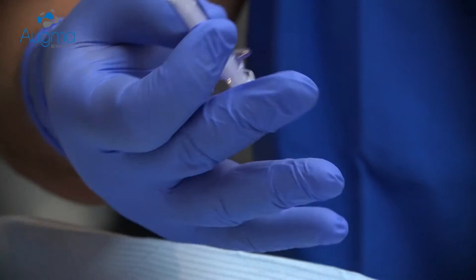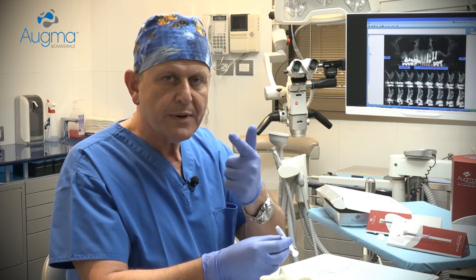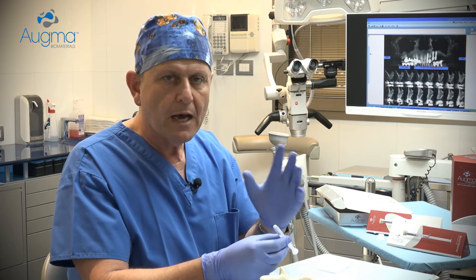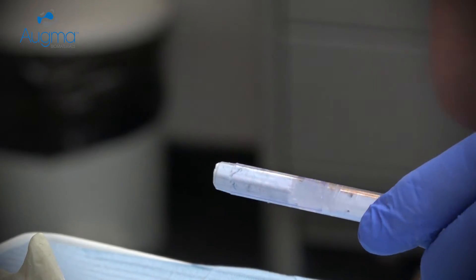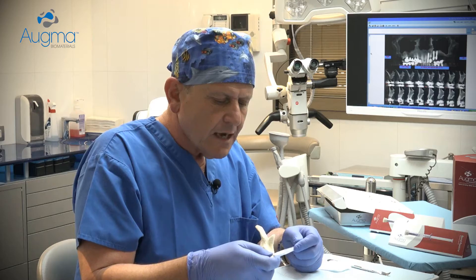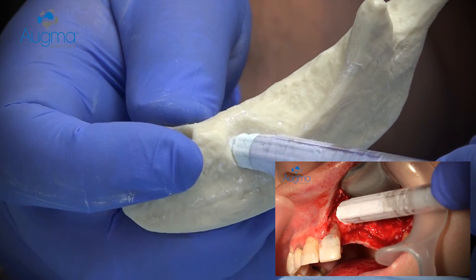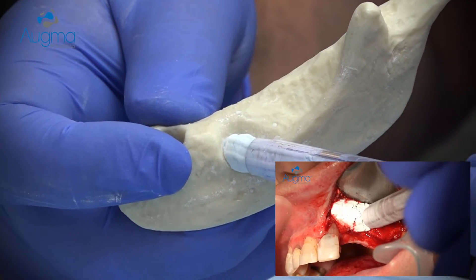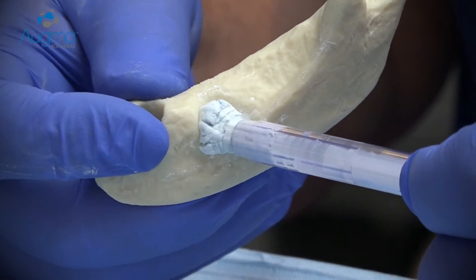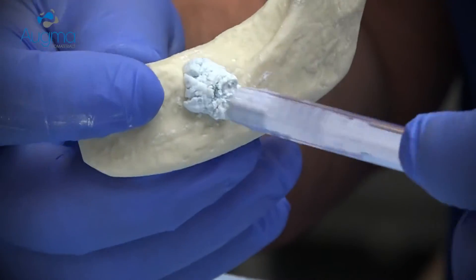All you need to remember to do is three simple consecutive steps: place, press, and close. In less than one minute, you can finish the entire procedure. Now let's do it together. Approach the defect site at a 45-degree angle and start ejecting the material into the grafted site. During the ejection, use the syringe head to help stabilize the material with a small condensing movement.